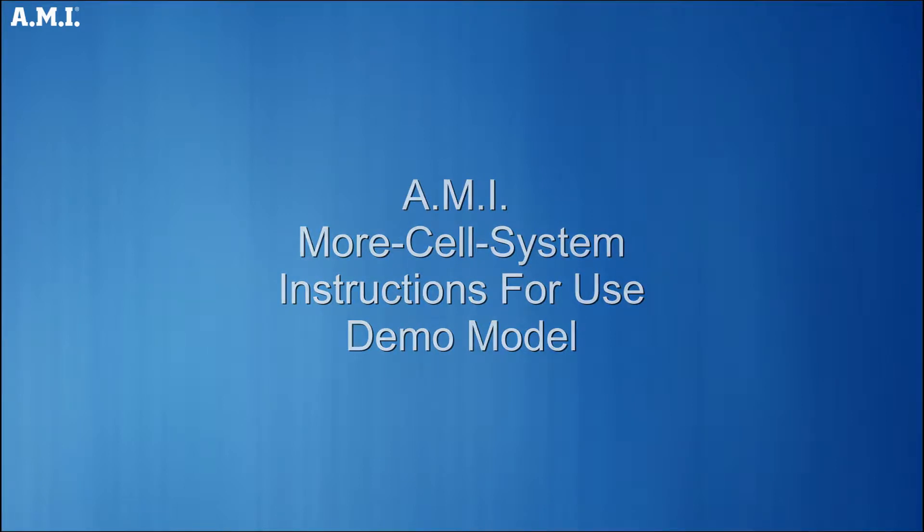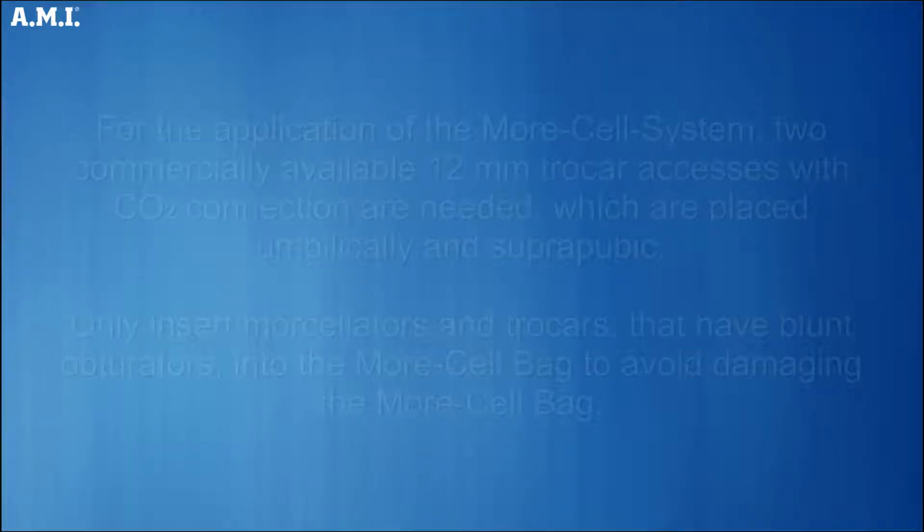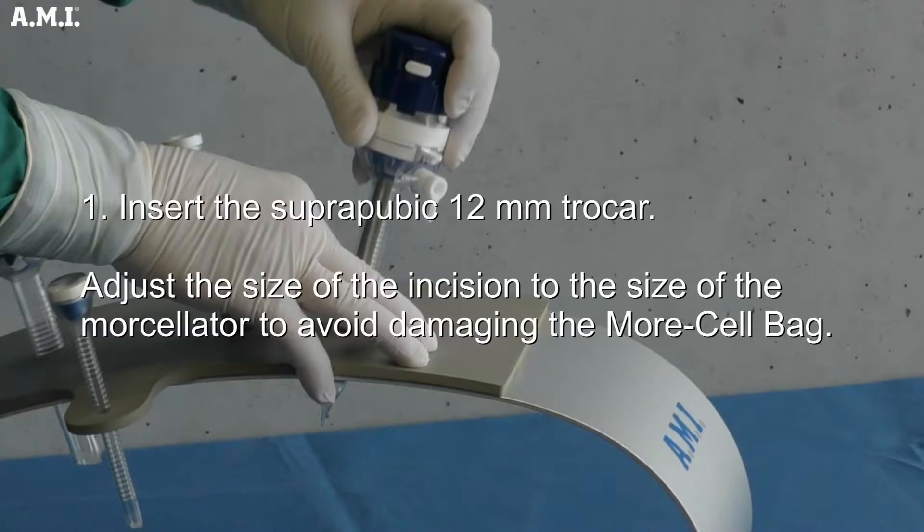AMI More-Cell-System Surgical Instructions. For the application of the More-Cell-System, two commercially available 12 mm trocar accesses with CO2 connection are needed, which are placed umbilically and suprapubically. Only insert morcellators and trocars that have blunt obturators into the More-Cell bag to avoid damaging it. Insert the suprapubic 12 mm trocar and adjust the size of the incision to the size of the morcellator.